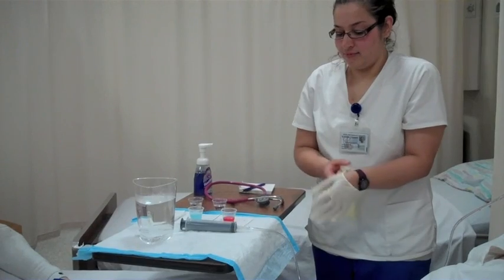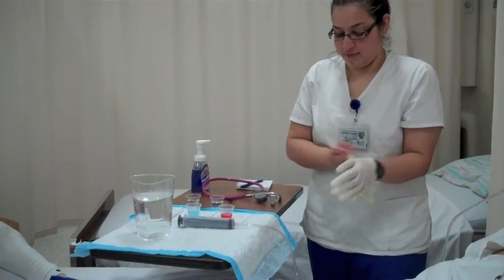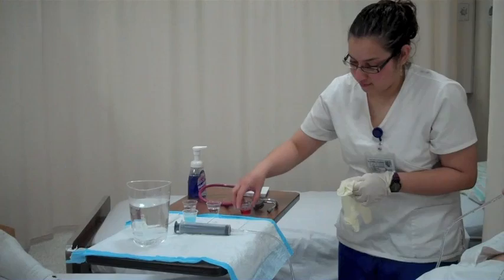For liquids, be sure to read the amount of medication at the bottom of the meniscus at eye level.